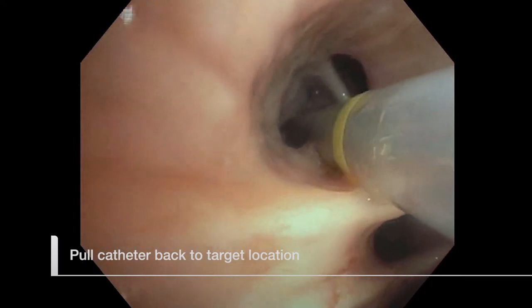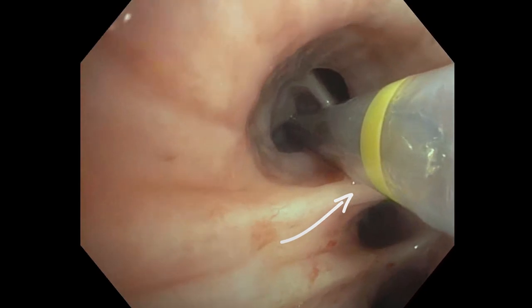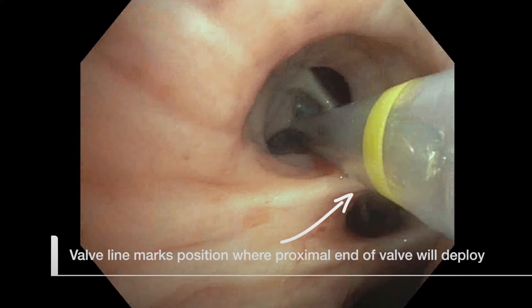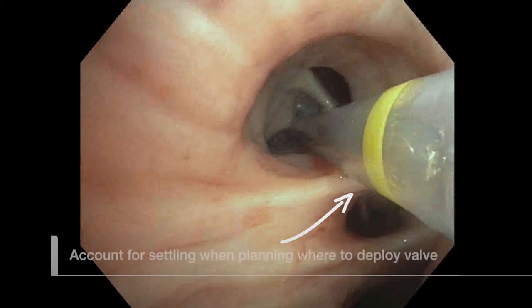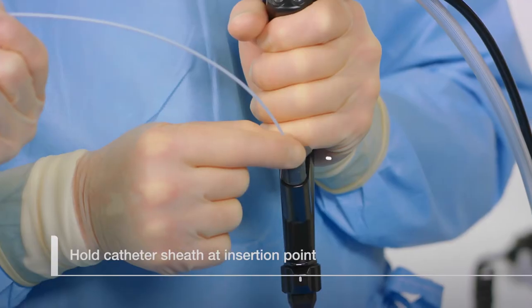Pull the catheter back slowly so that the yellow valve line is at the target location. The valve line marks the position where the proximal end of the valve will contact the airway wall once deployed. After deployment, the valve may settle distally over time, so the bronchoscopist should account for this effect when planning where to measure and deploy the valve.